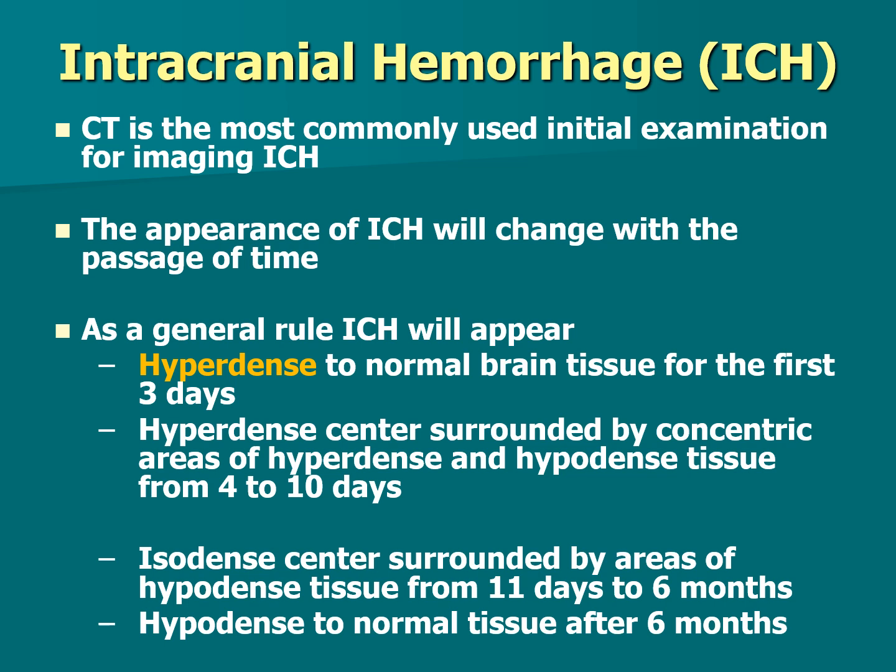The appearance of the intracranial hemorrhage will change with the passage of time. A fresh bleed is going to be hyperdense. As it dissolves down or goes over a period of time, it's going to become less dense. It will become isodense to the brain, and then when that brain tissue dies, it will become hypodense, less dense than the brain because fluid will fill in.